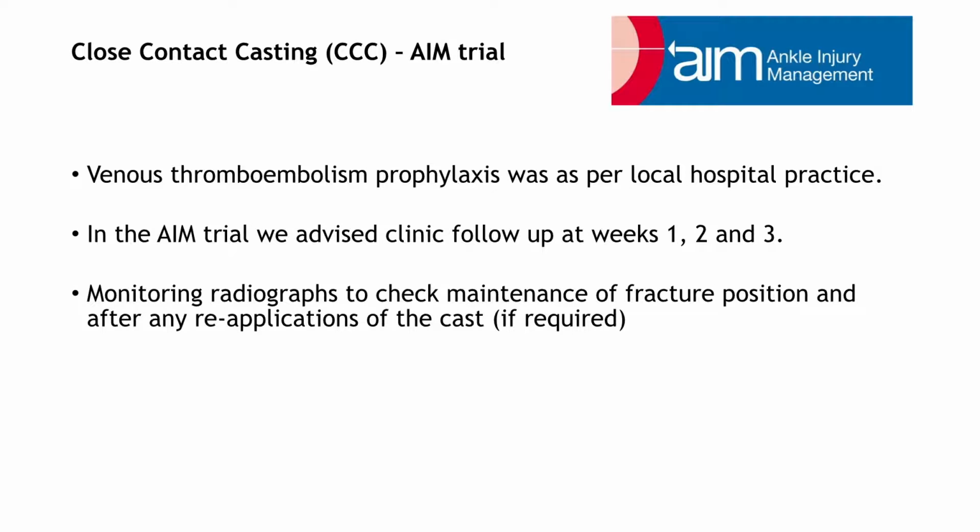After application of the cast, each hospital in the AIM trial followed their own VTE prophylaxis protocols. We advise clinic follow-up with an orthopaedic surgeon at 1, 2 and 3 weeks after application of the cast to monitor the patient's cast and fracture position. At these clinical follow-up appointments, monitoring radiographs are used to check maintenance of the fracture position achieved in theatre.